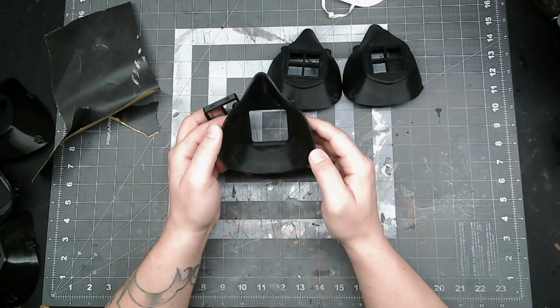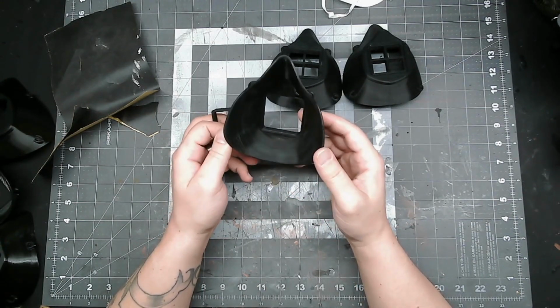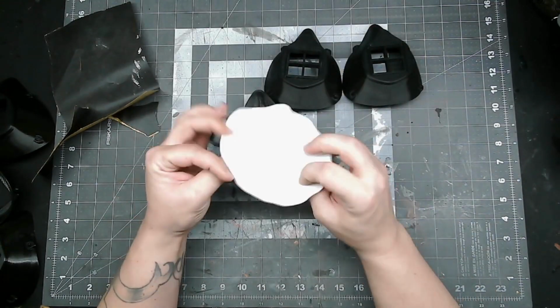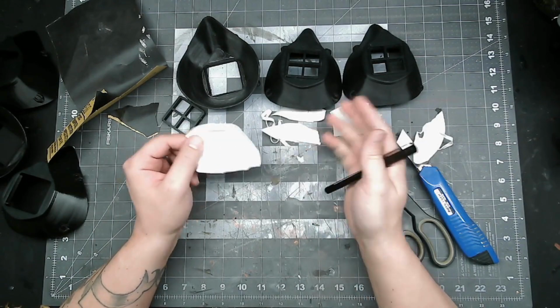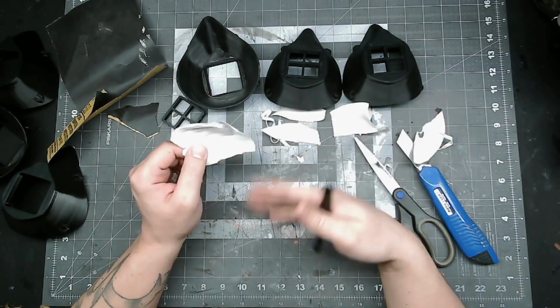For the filter, you'd want an N95 mask. What this thing does is it extends the life of one of those masks by turning the one mask into 6 filter pieces. I don't have any of those. I do have this dust paper filter that I can use just to show you what I'm talking about. So obviously if you're doing this to a real proper N95 mask, you want to be more careful than what I did here. I'm just trying to cut it quickly to show you.